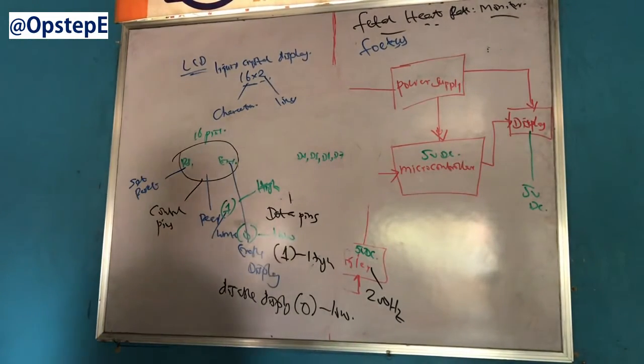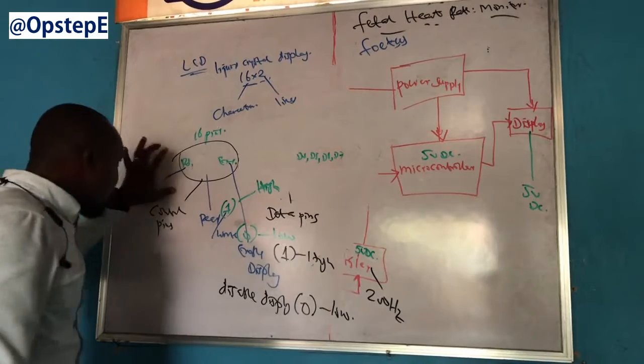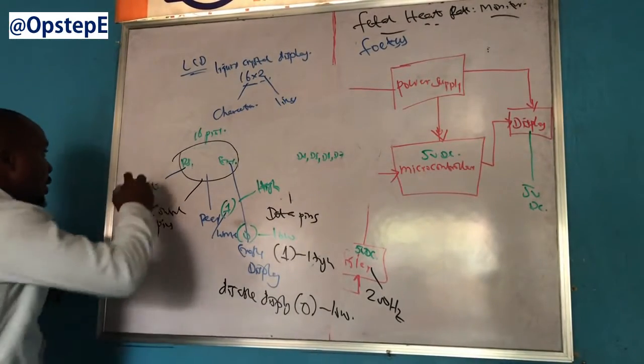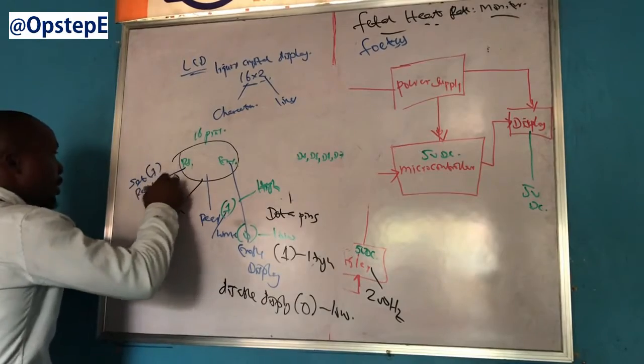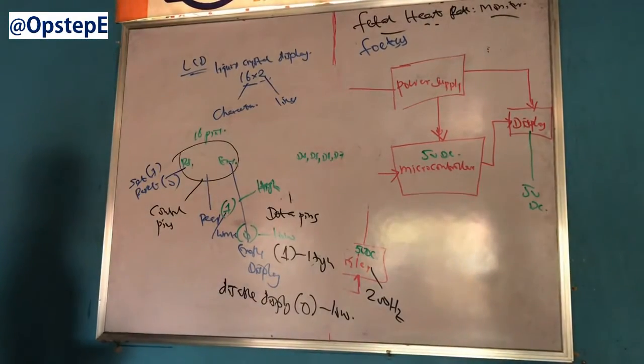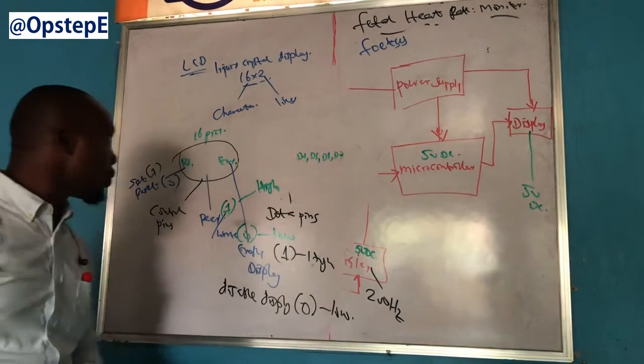Okay. Then for the set reset, the state of this pin will start going from set to reset. On the set, it's a high. On the reset, it's a 0. So at the point of issuing command, let me just say this quickly.